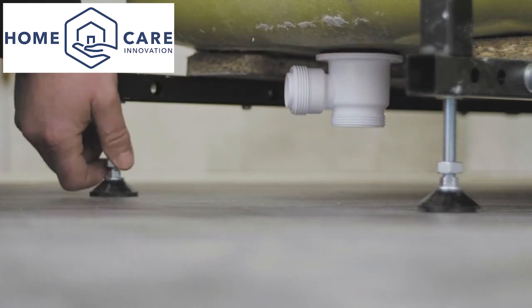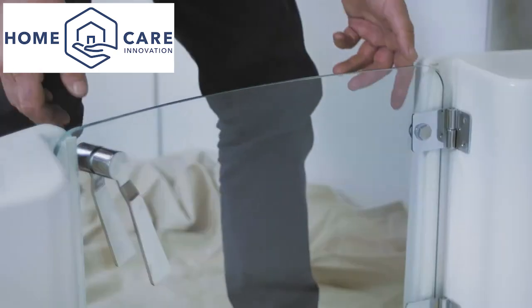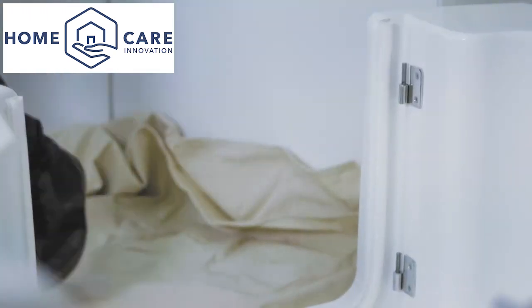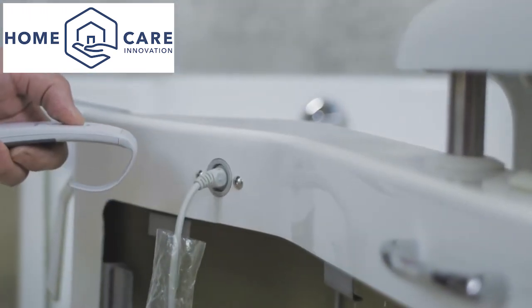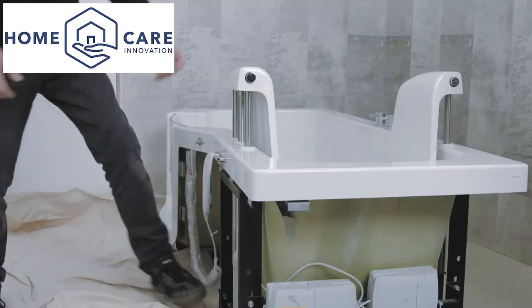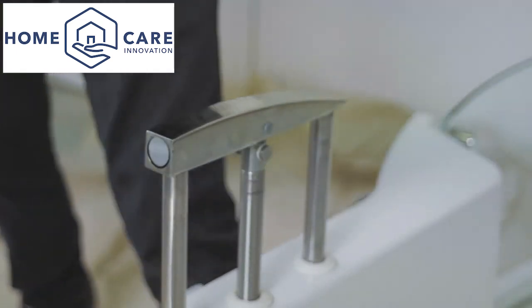When moving the bath, we recommend that the door and seat are first removed. The door can be removed by simply lifting it off as shown. Do not unscrew the hinges. To remove the seat, plug in the handset and use the battery power to power the seat halfway up, then allow easy removal by pressing in the two chrome buttons on the back of the seat.